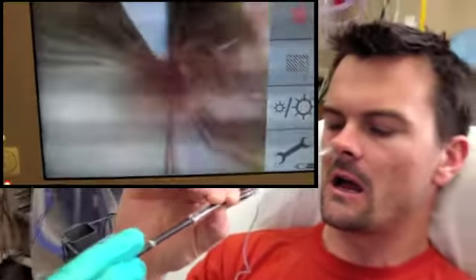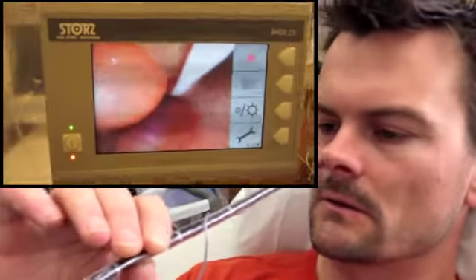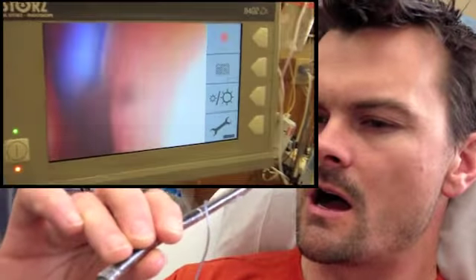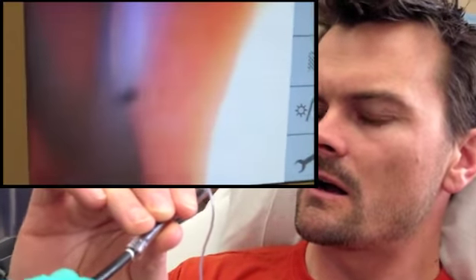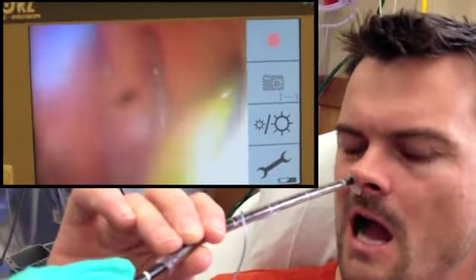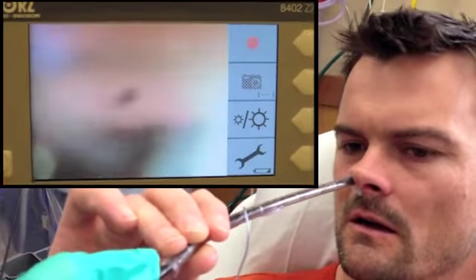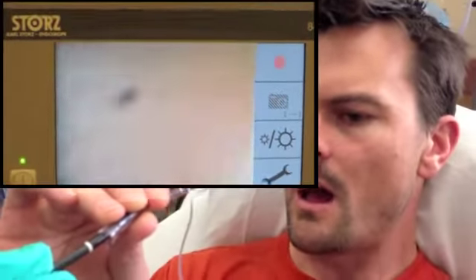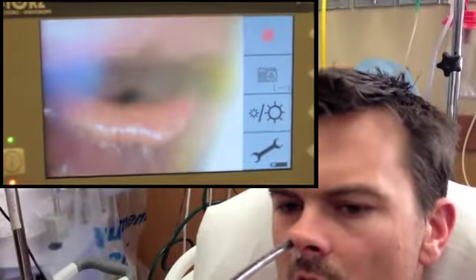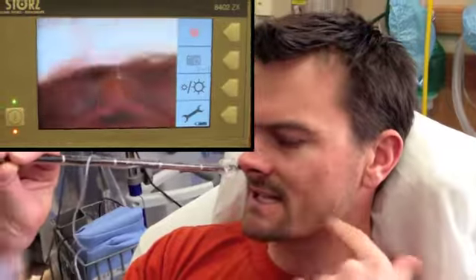So you're going to take the endoscope and insert it through. There we go. Getting a little bit of friction just because it's from the tube. There it is. Okay, so we're in the pharynx. There's his epiglottis. A little bit of fogging, but you can see the cords. We're going to pass this thing through the cords.